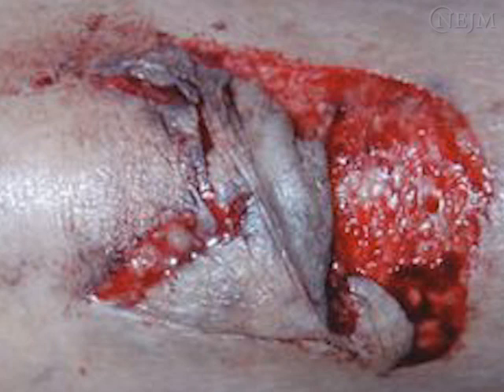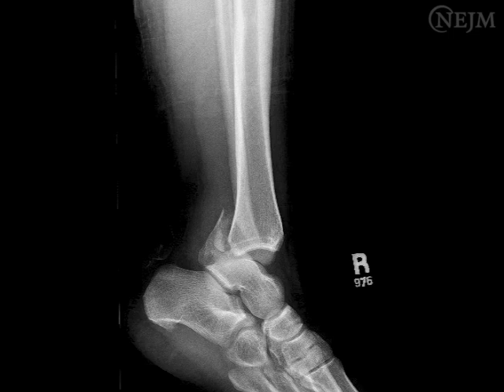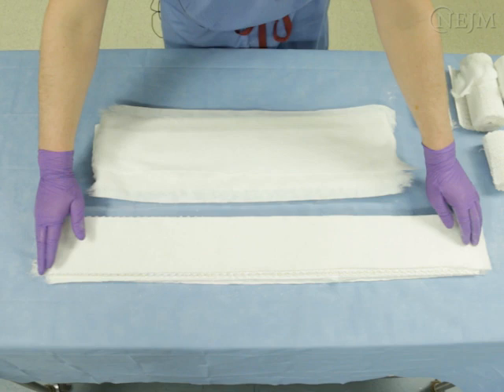The use of hot water or the application of too many layers of plaster can induce clinically significant burns. An incomplete reduction or a loss of reduction can cause skin damage. It is also important to use sufficient padding, especially around the bony prominences, to avoid skin breakdown.